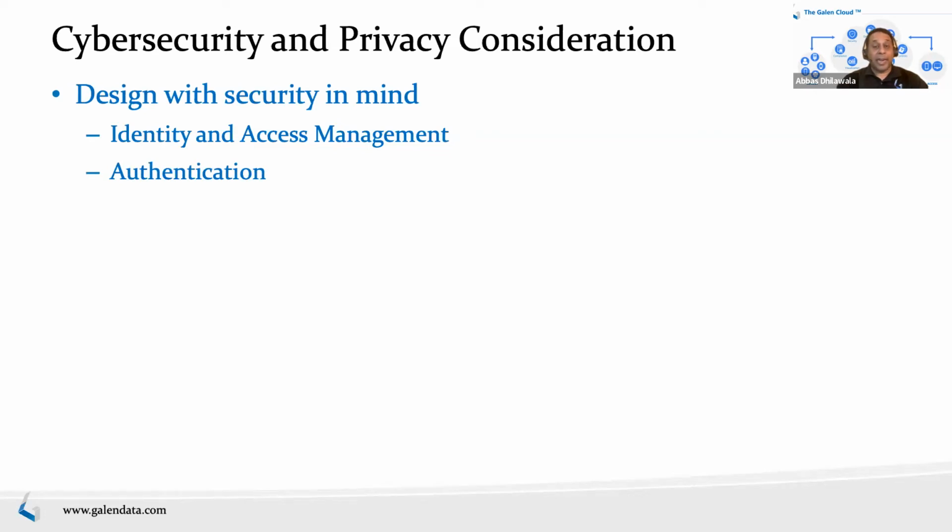So how are you authenticating devices, and how are you authenticating a user? Is it requiring the user to put in a PIN, a username, password, biometrics? What are those different mechanisms you have? And then if some of these functions are critical, you also want to understand what the backup is, or whether you allow certain things to happen on the device itself. There are buttons that do things on the device that can be done at any time, but if you're doing it remotely, you need authentication. So things like that.